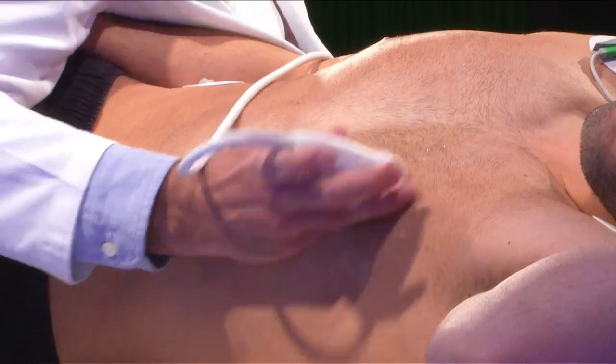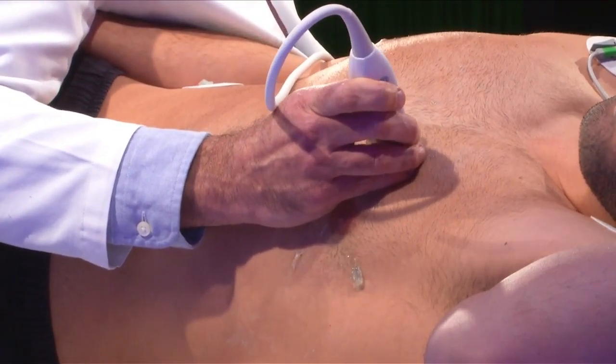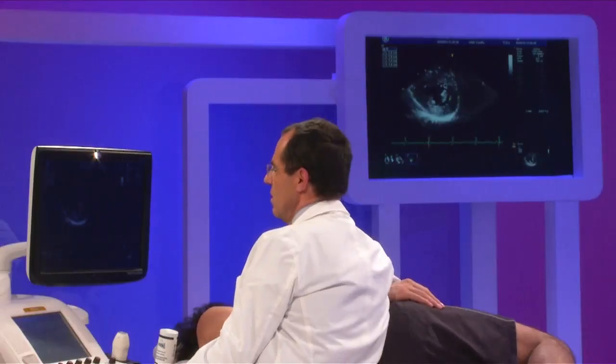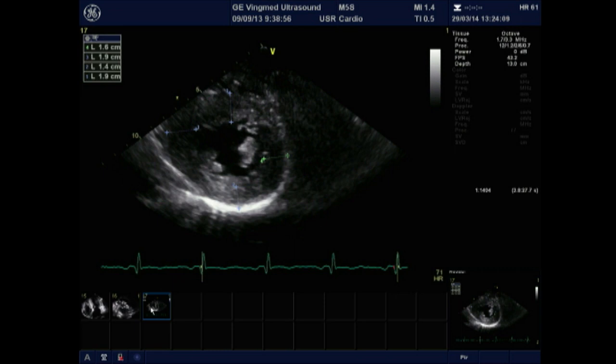And in the short axis view, we can confirm our previous visual impression that the hypertrophy is essentially concentric, but with predominance of the thickness of the septum. So to conclude, I would say that in a patient with known amyloidosis, the diagnosis is easy, but in a patient without known amyloidosis, there are some echocardiographic features that must let us think about this disease, some red flags.